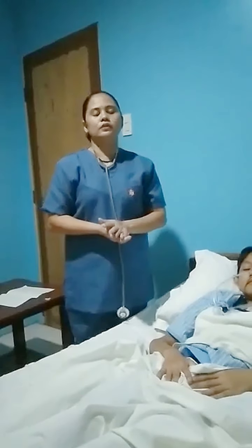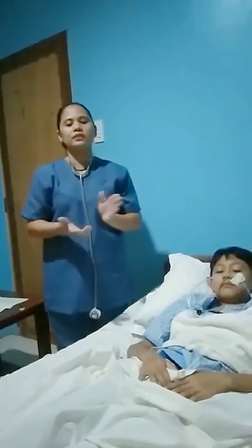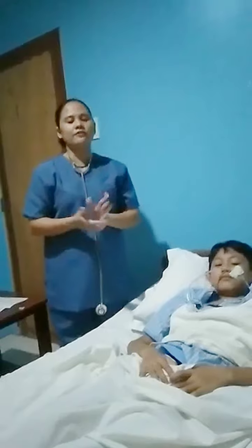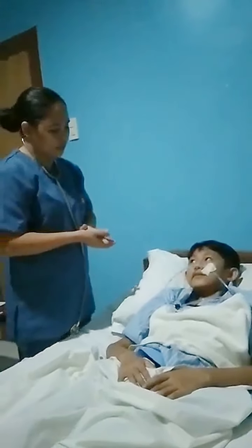For evaluation, the very first thing is we have to assess the patient's tolerance during the procedure. Is there any discomfort, coughing, or gagging? Also for evaluation, we have to note the color, consistency, and the pH of the aspirate. Next, we have to ask the patient if he is comfortable. Sir Ryan, are you feeling comfortable?